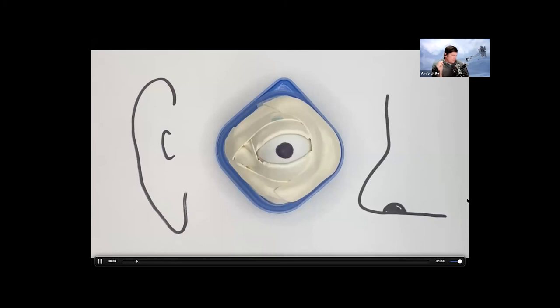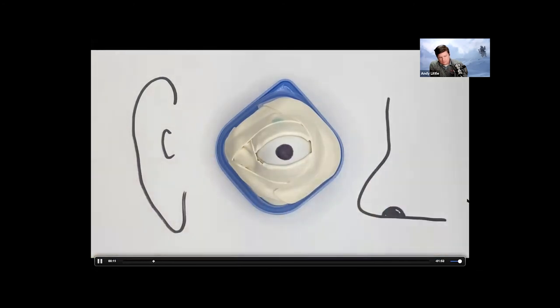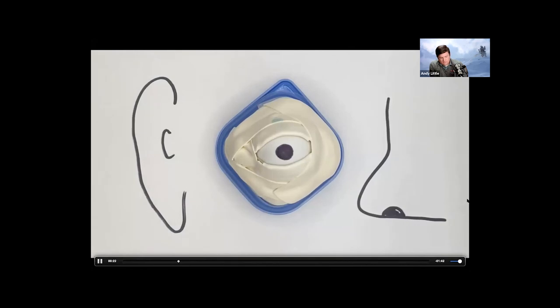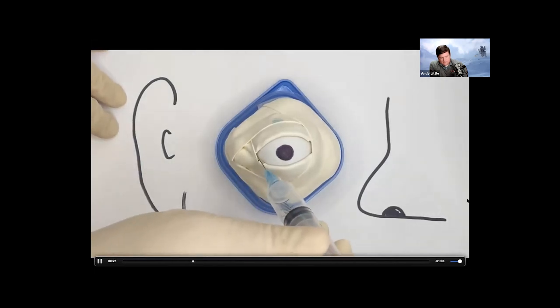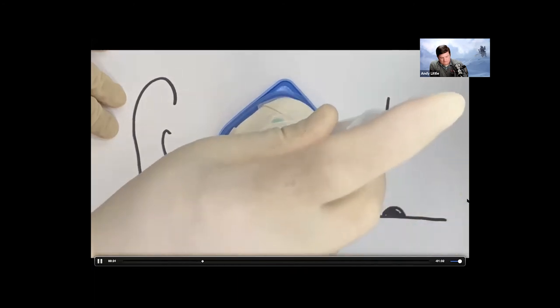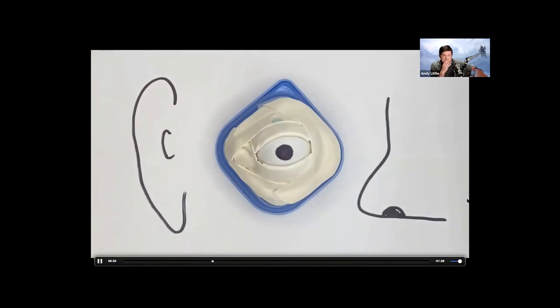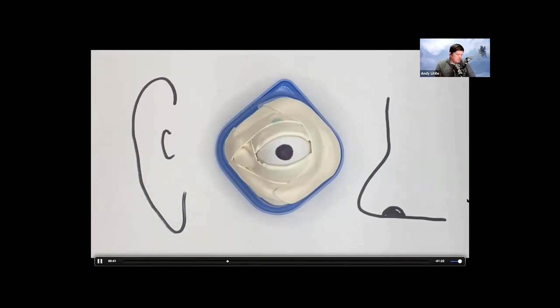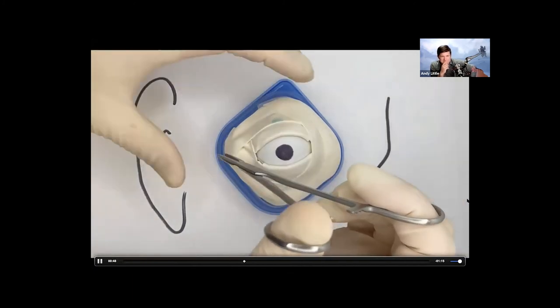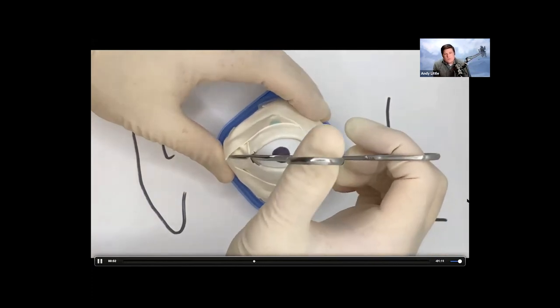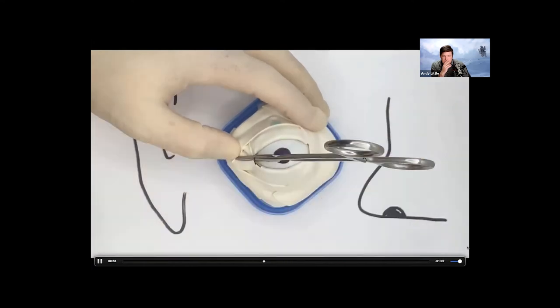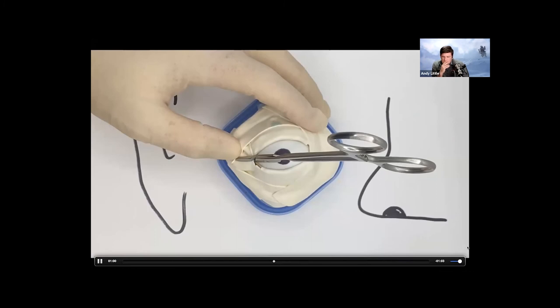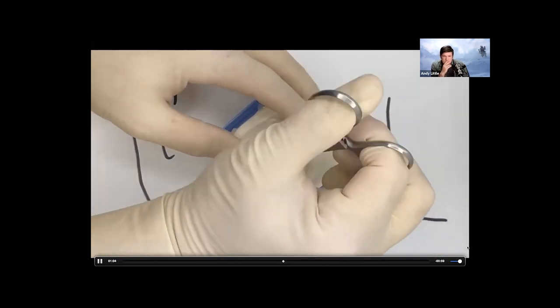All right, so we've decided that our patient needs a lateral canthotomy. For this video, we're going to assume that that squiggly line on the right is going to be the patient's nose, while those squiggly half circles on the left is the patient's ear with our model that you can find in the show notes is in the middle representing the patient's eye. So we decide our patient needs lateral canthotomy, and we're going to anesthetize the area we're going to cut using 1% lidocaine, with or without epi. Either one's fine. You're going to anesthetize the eye. I want to make sure you anesthetize multiple areas, every place you're going to clamp, every place you're going to cut, as this is a painful procedure. So we wait a little bit, make sure our patient's got some anesthesia, and then we decide, all right, we're going to use a straight forcep from our laceration kit, and we're going to bury it down, traveling on the outside of the eye, and we're going to clamp down for 5 to 10 seconds. Now as you're clamping down, you're going to verbalize to the room what you're doing, why you're doing what you're doing, and the indications for what you're doing this for.